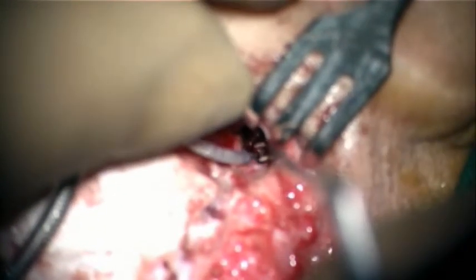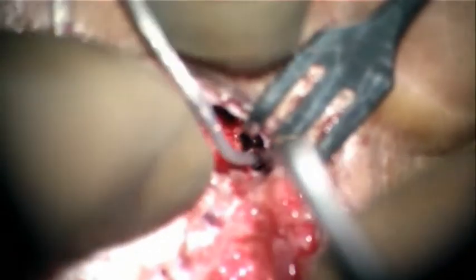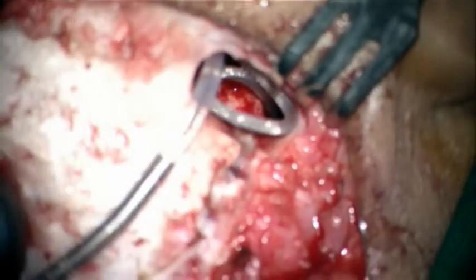This needs to be done very gently so as not to damage the cochlear implant. Once it is inserted all the way up to the marker ring, it is coiled carefully in the mastoid and checked to see if the device is functioning properly. Once this is clear, the incision is closed — hemostasis is achieved first, and then we close it in layers. The cochlear implant is coiled very carefully in the mastoid cavity.